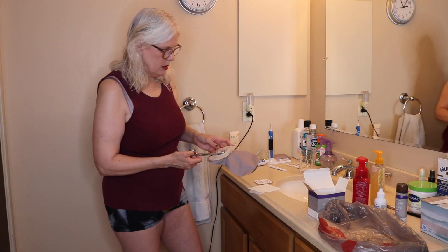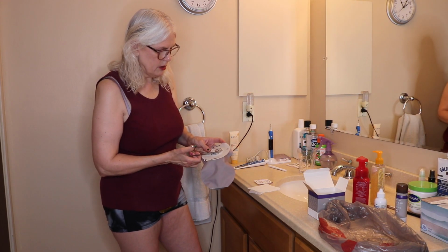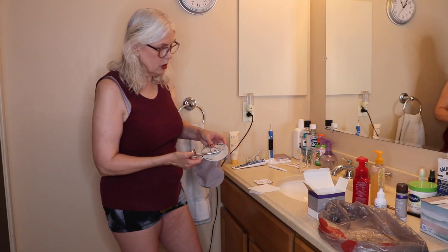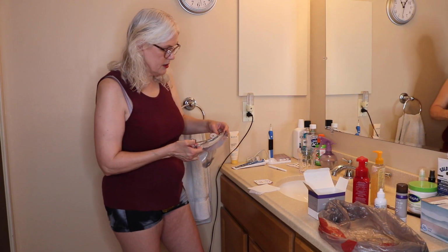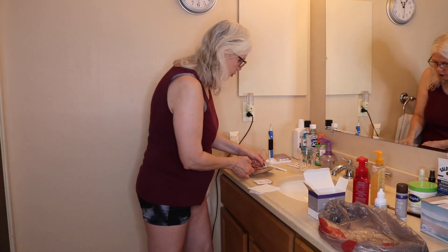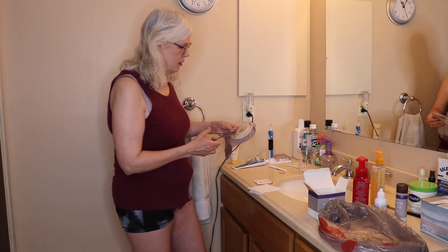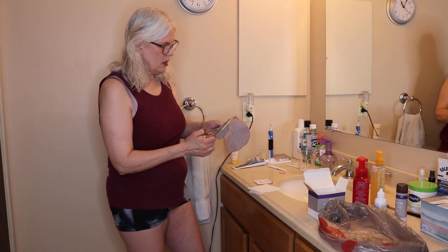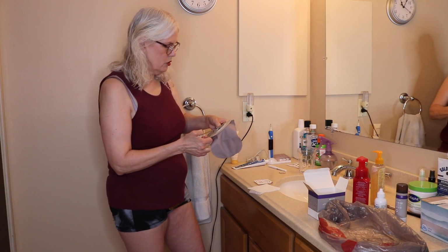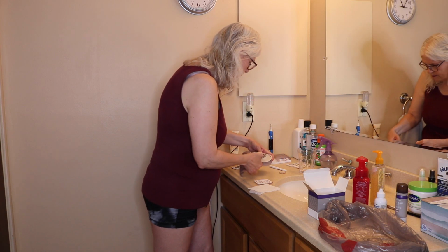So we're just going to go ahead and cut this. Now again, a lot of people, when you have stomas, you know your size already. You know what kind of hole you want. You can use the guidelines that are on here if you're going center. Even if you're going not center. I used to cut it without marking it first. And now I've gotten to the point of, I think I'd just rather mark it. And then I know for sure that I usually don't have to come back and cut it bigger again.